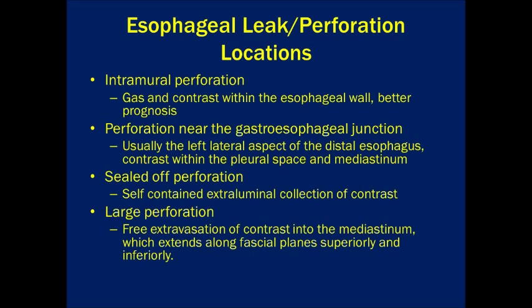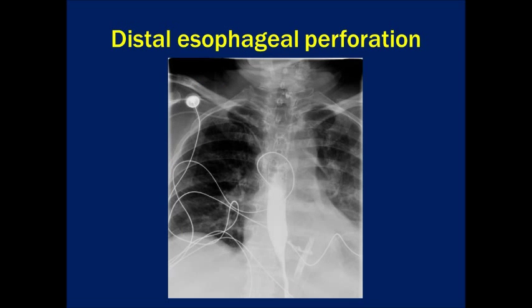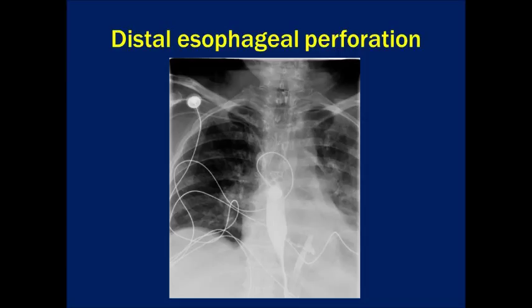There are multiple locations and types of esophageal perforations and leaks. The following slide has a list of these leaks which can be browsed at the viewer's leisure. Here is a nice example of a positive esophageal leak study. As you can see, there is extravasation of contrast from the esophageal lumen to the left of the gastroesophageal junction — a very common location.